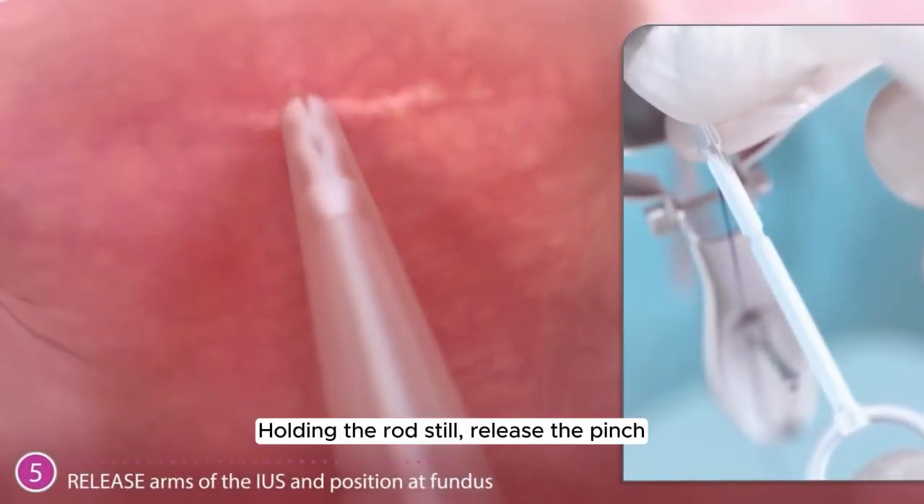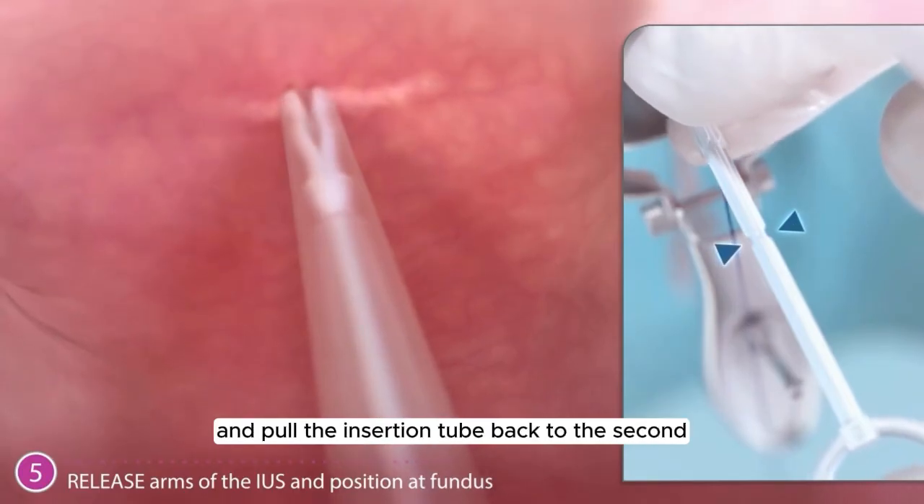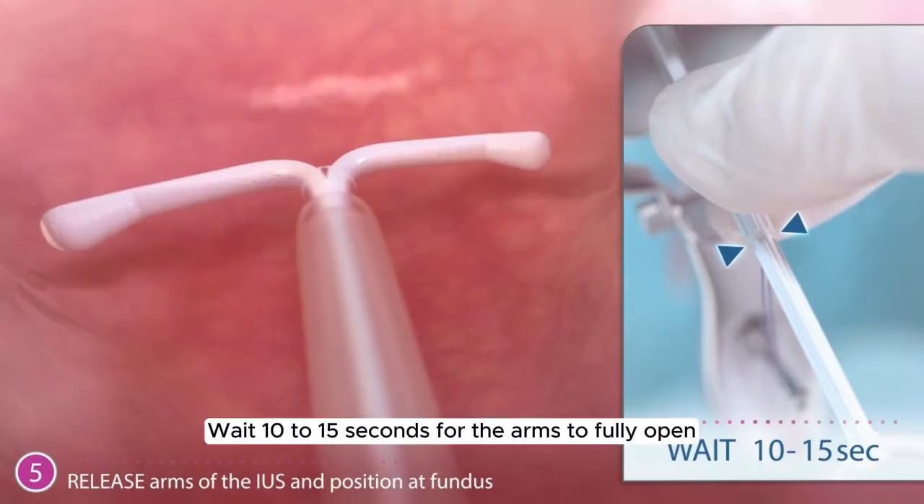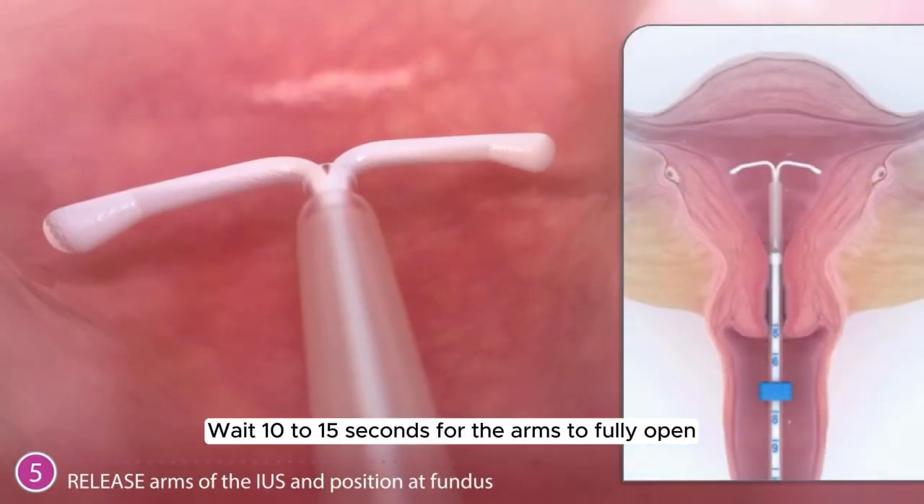Holding the rod still, release the pinch and pull the insertion tube back to the second, bottom indent of the rod. Wait 10 to 15 seconds for the arms to fully open.